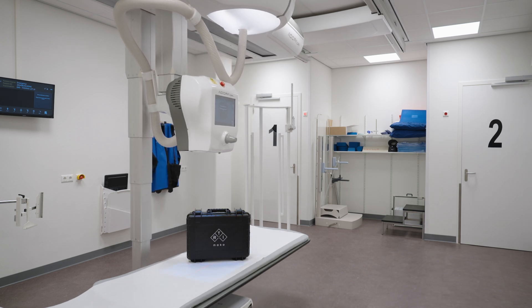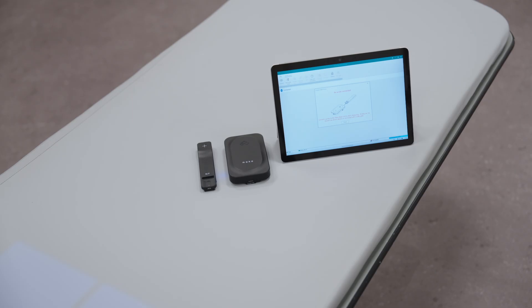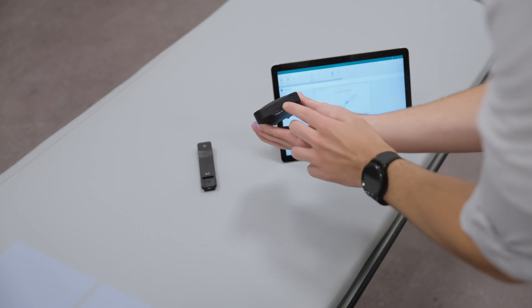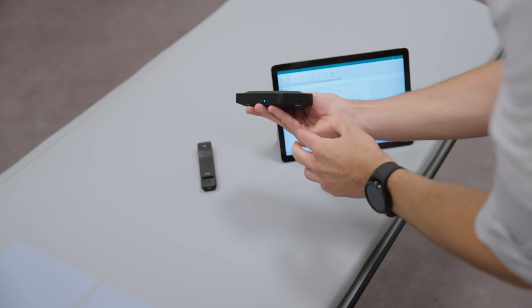To set up and measure KV and dose in radiography applications such as conventional x-ray, CR and DR, first switch on the Mako base unit. The solid green light will display.